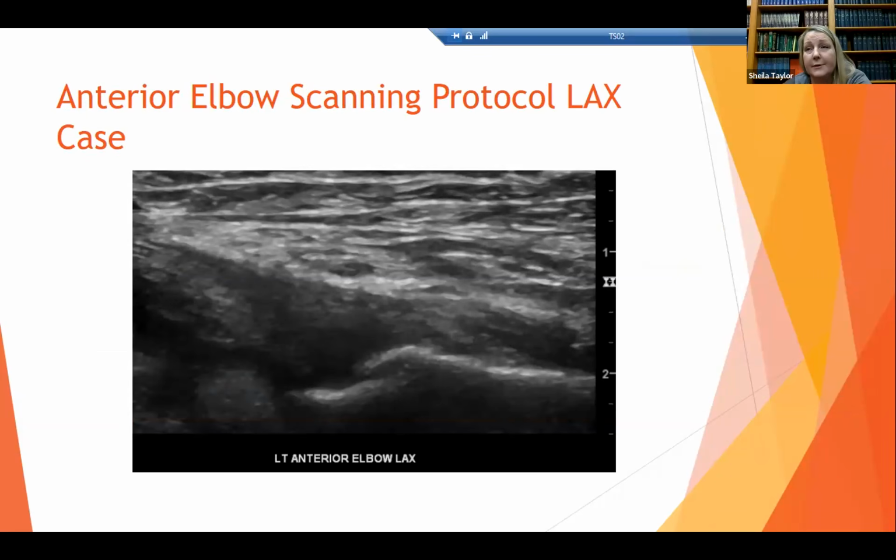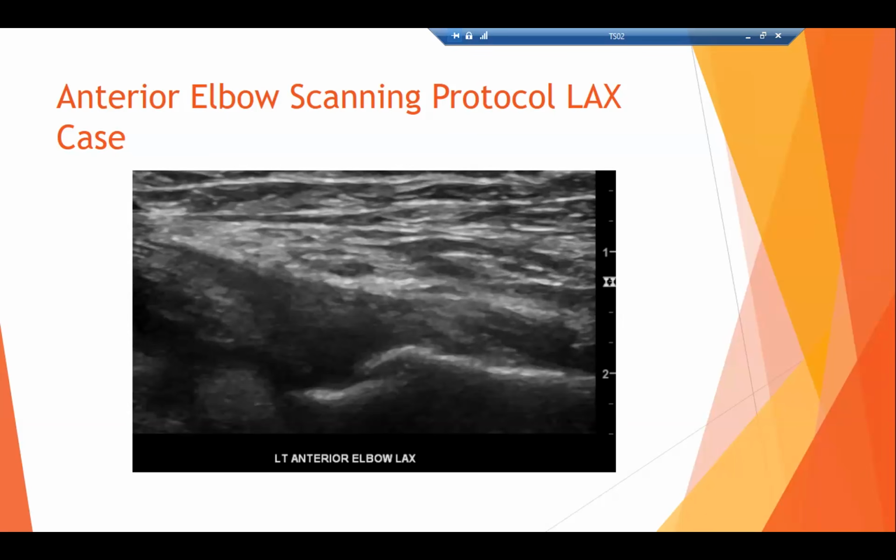And from an inferior approach, in line with my ultrasound probe, in plane, inferior to superior. Yeah, that's been my experience, because when you pronate to see that tendon from that Cobra view, you're actually squeezing the bursa, so you're limiting fluid in that position. That's been my experience as well. I think it's hard to aspirate, but if there wasn't a huge bursa and you were just trying to put fluid in, that certainly could be an approach, and an easier or safer approach when you're first starting out.